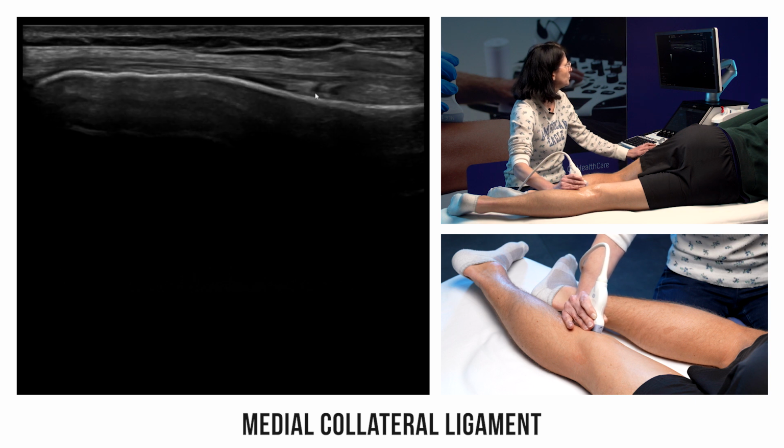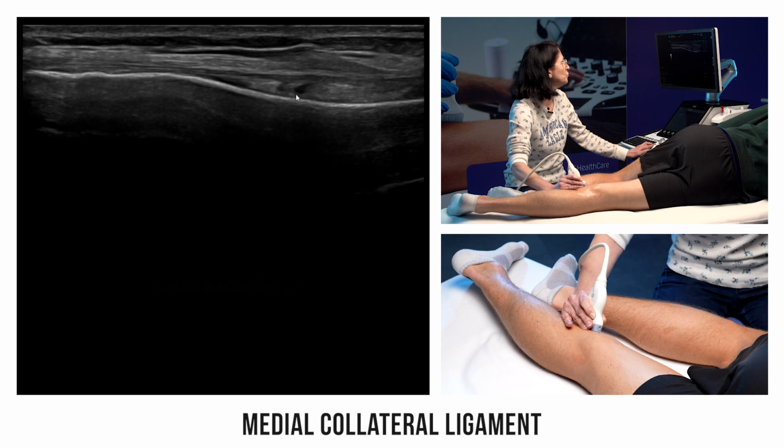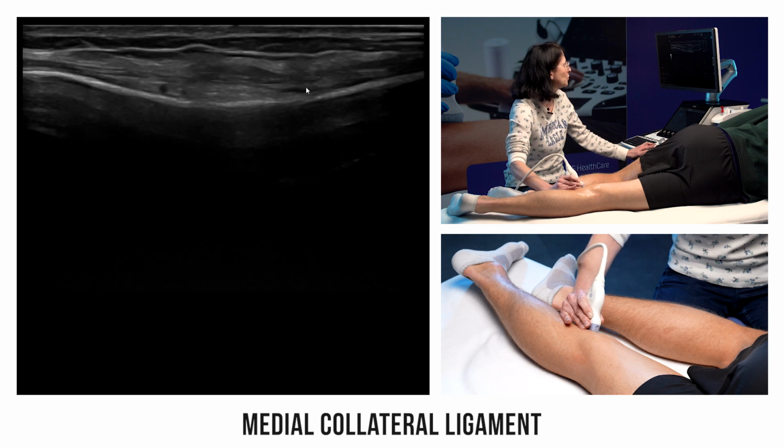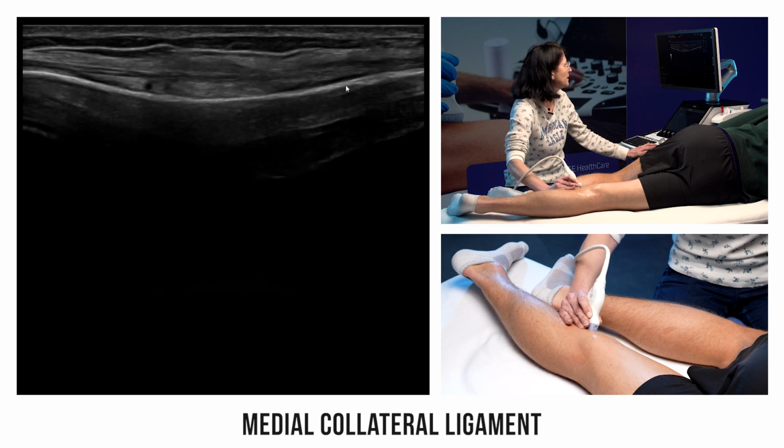Here we go, continuing downward. You can see that the ligament always covers one or here two small arteries, the medial inferior knee arteries, which separate the ligament from the cortex. We have to continue down to find the distal insertion of this medial collateral ligament.